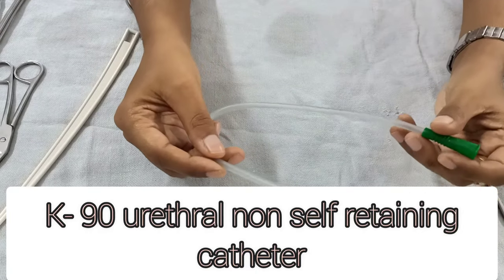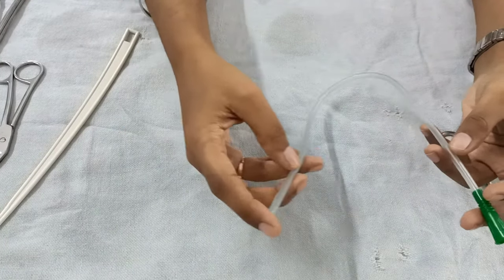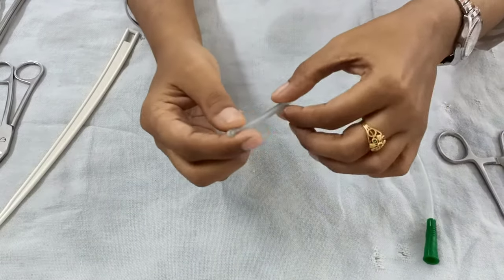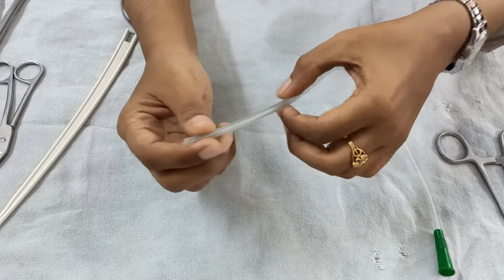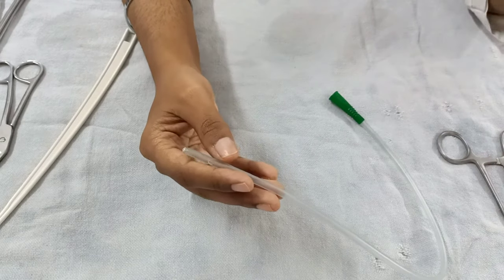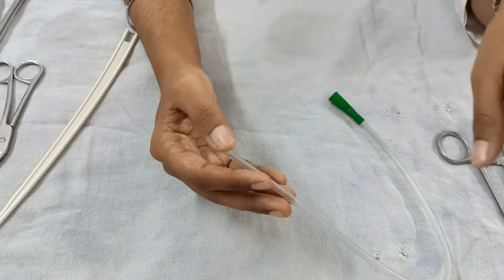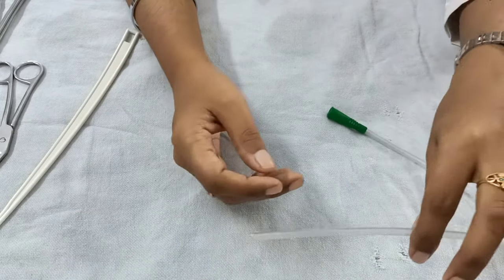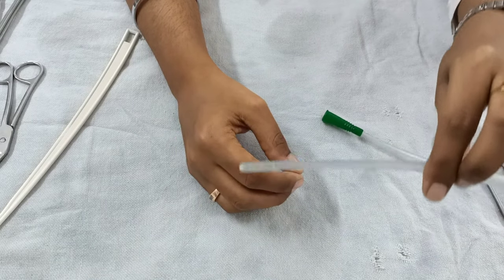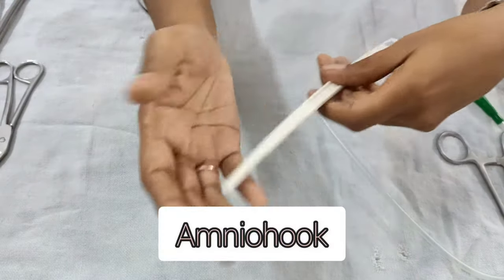The next instrument you require after cleaning the perineum is the K90 urethral catheter. This K90 does not have any balloon as seen in a Foley's catheter — it is just an in-and-out procedure. In case a patient is in labor and going to deliver but has not passed urine yet, it is important to empty her bladder before delivery of the baby.